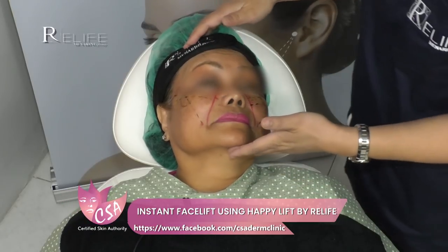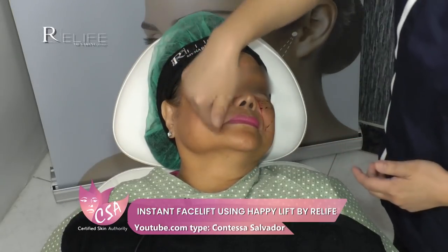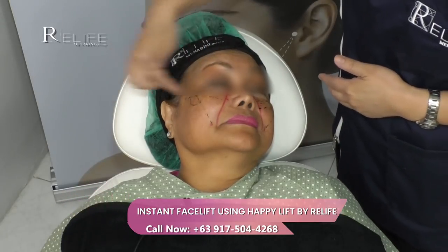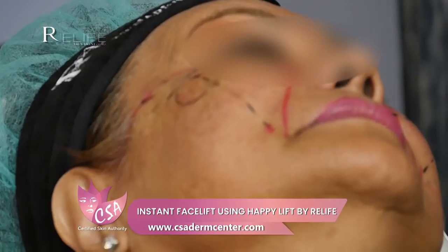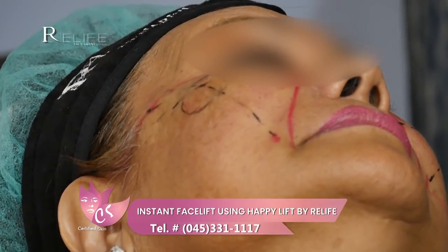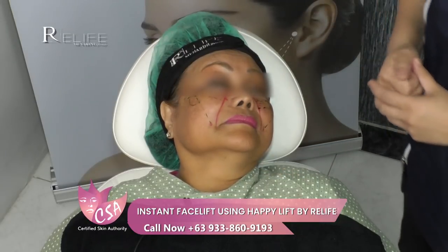We will have three entry points on the first safety line and three exit points on the second safety line. We have intermediate lines — that's where we will be inserting our polycaprolactone threads. We're doing reshaping with three reshaping lines, and the goal is to lift the lower to mid-face area, repositioning our fat compartments.